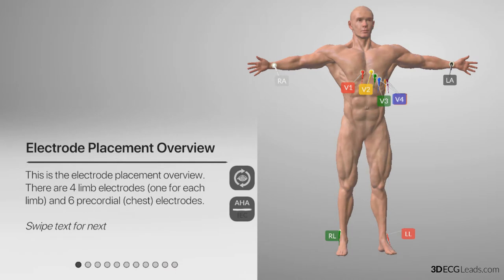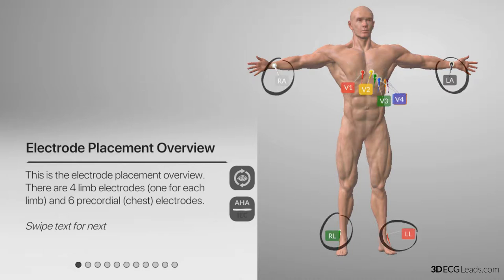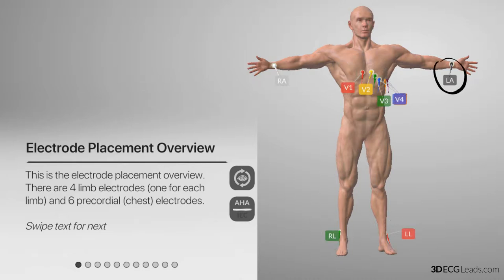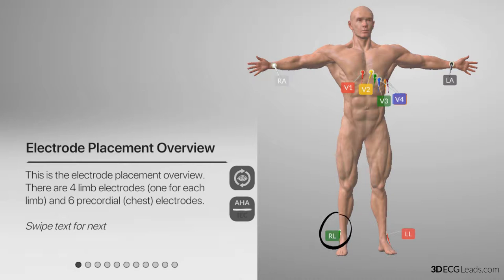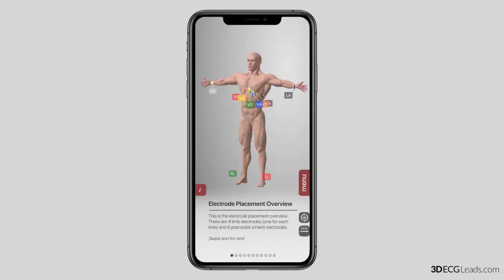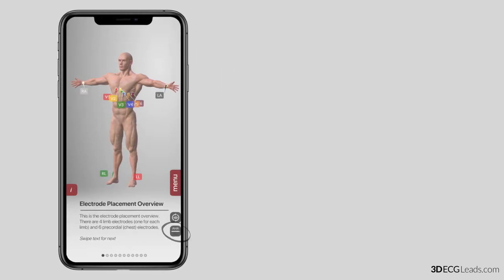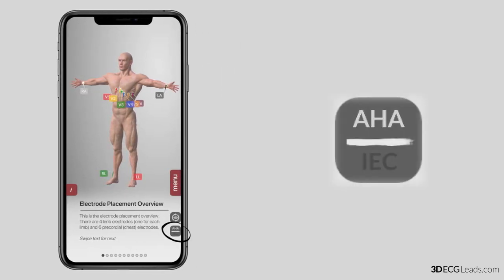There are 10 different leads that serve as electrodes: 6 of which are placed on the chest and 4 that are placed on the limbs — LA, RA, RL, and LL. The colour coding system being used throughout this video is called the American Heart Association Colour Coding System, also known as AHA.